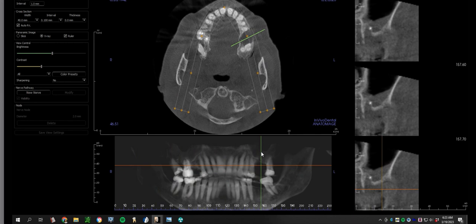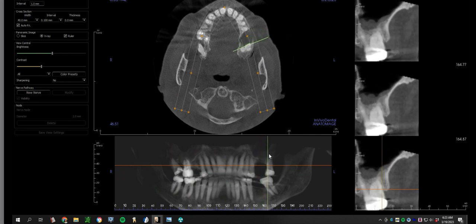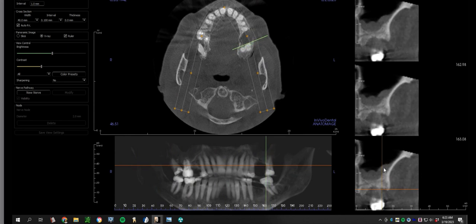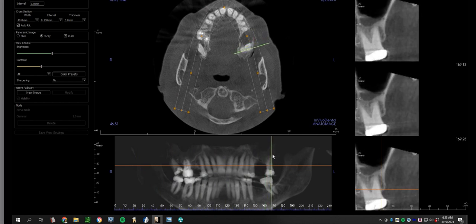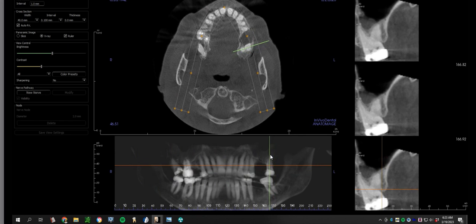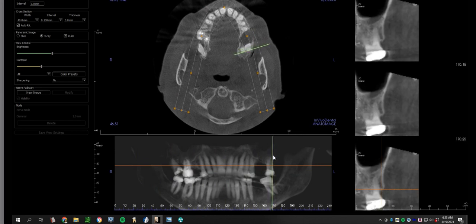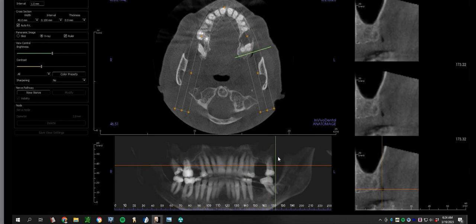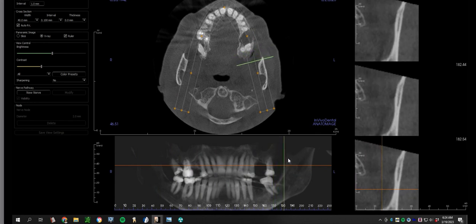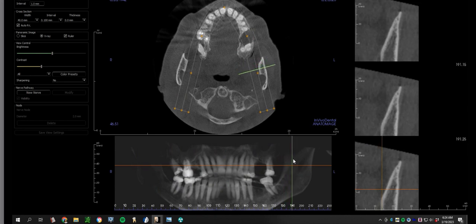So now I'm coming back over to the green line, and let's take a look at tooth number 15. Again, just general swelling of the nasal mucosa of the maxillary sinus and the nasal mucosa. So I think this patient really would benefit from our ENT referral. Tooth number 15 looks good, at least radiographically. But I continue moving on. I want to make sure that there's nothing that looks weird or aberrant in this section here.